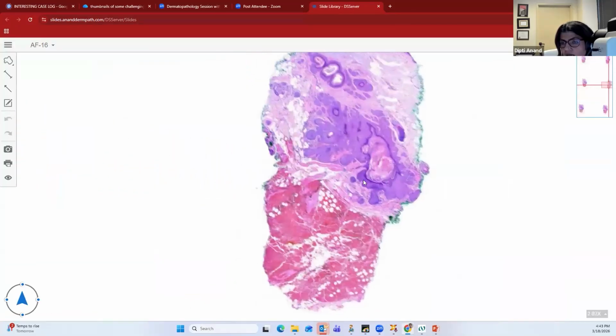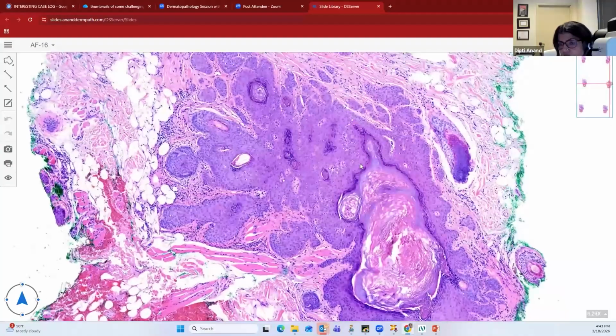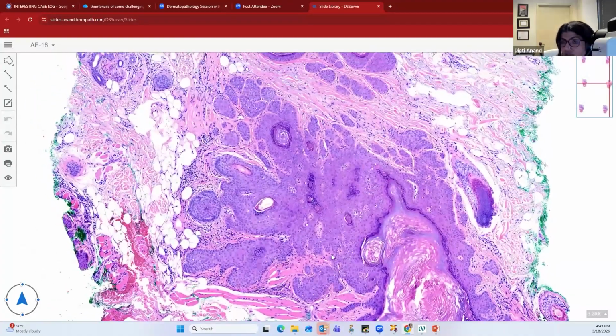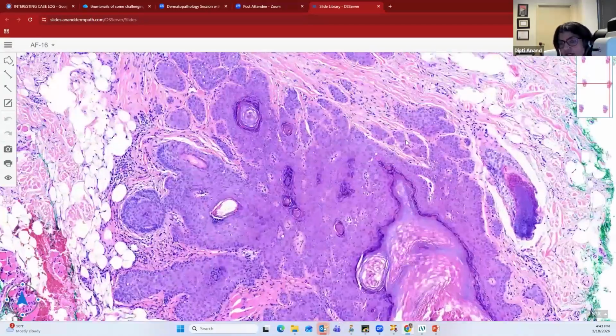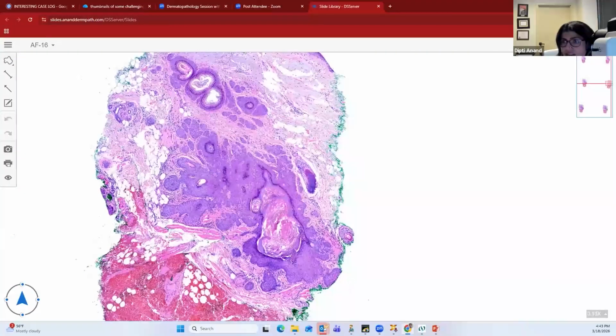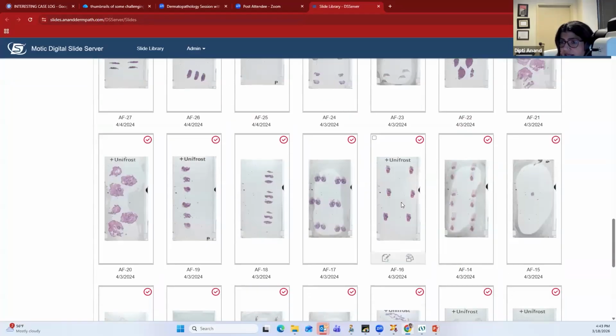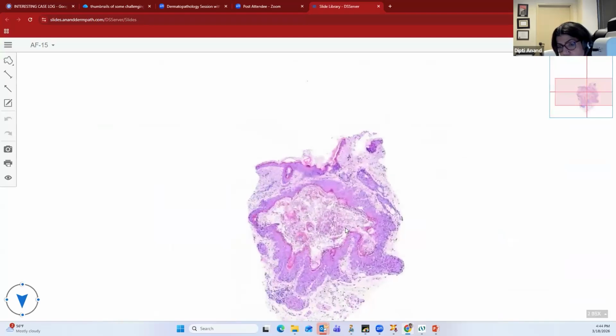So in a pilar sheath acanthoma, you again have a central cystic invagination, and the wall of the epithelium is much more thick and has these acanthotic pink buds arising from it. That's your pilar sheath acanthoma.